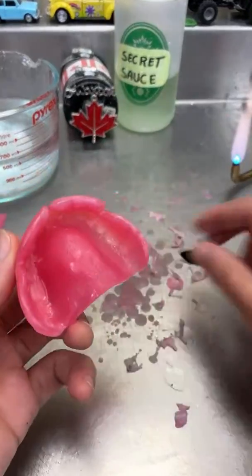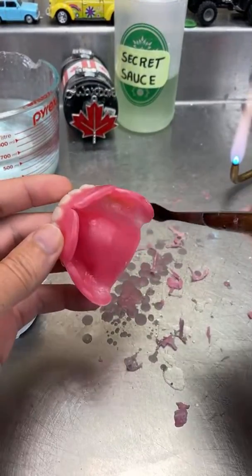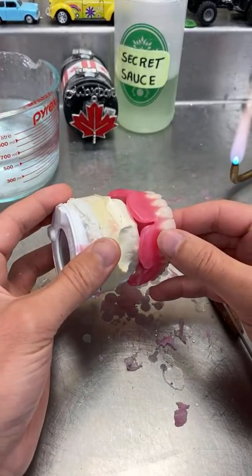So I basically just trim those edges with the fire and smooth them out. And now what I'm gonna do is put it back on the model.